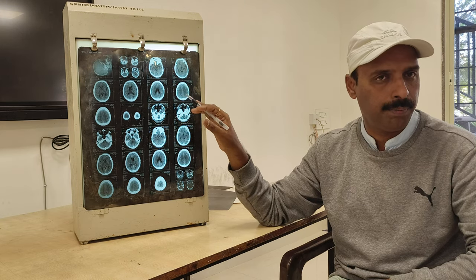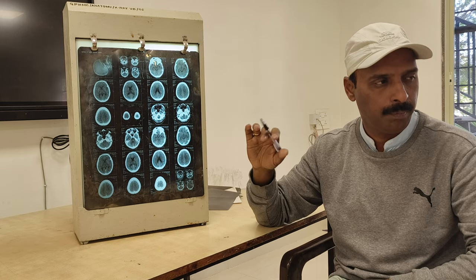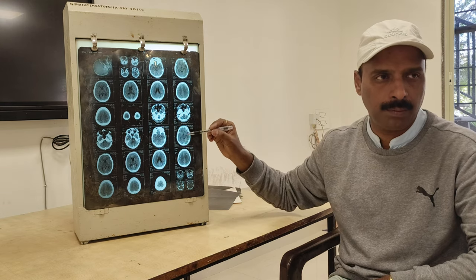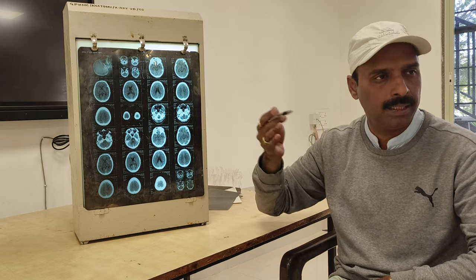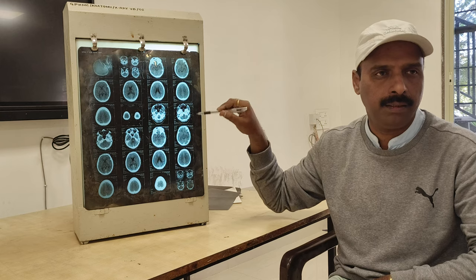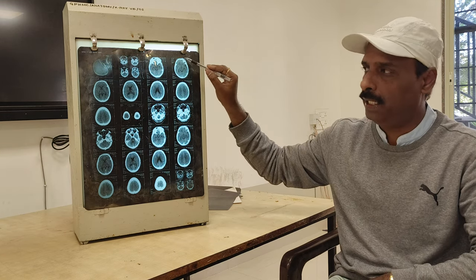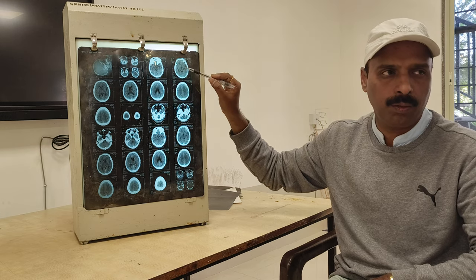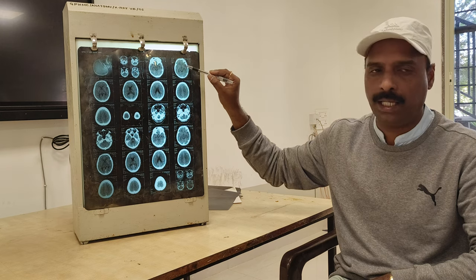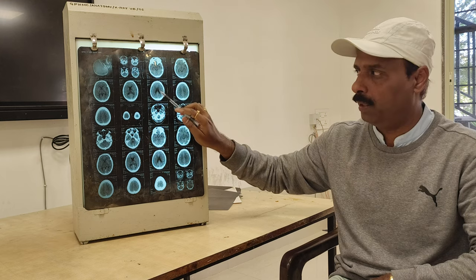CT scan of brain, this is computerized tomography. In this, at all the different levels of the brain, we are going to take sections, different sections, for imaging. You can see the outer cranium, and in the center you are going to get the brain, the cerebrum. Then you can see both the lateral ventricles in one image.